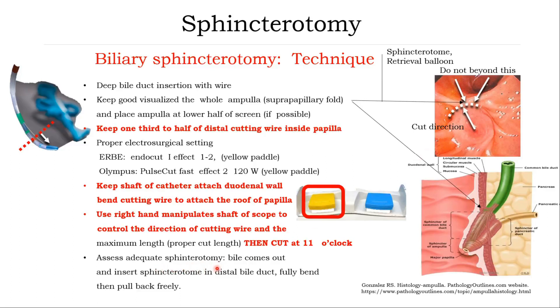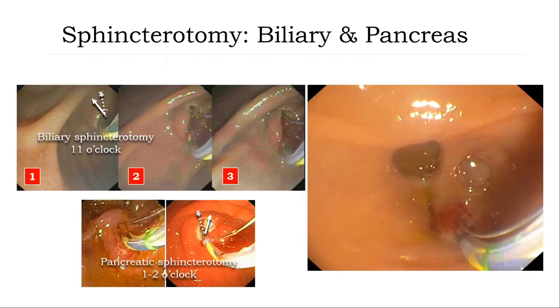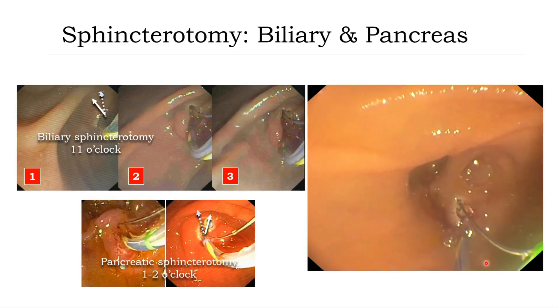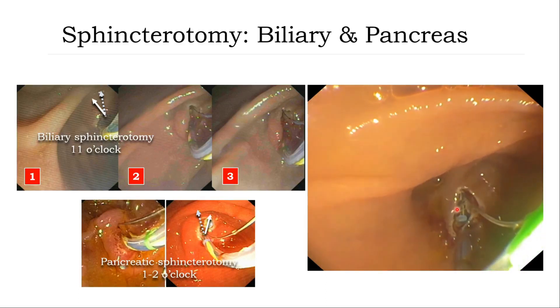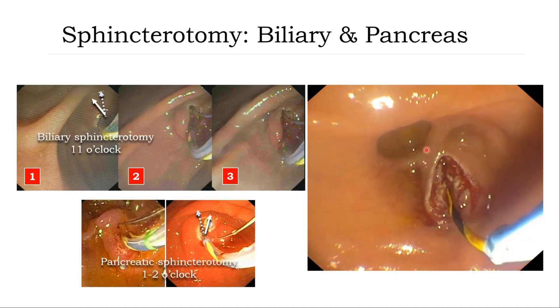Adequate sphincterotomy: you can see the bile duct come out and when you fully bow the sphincterotome, you can put a catheter in and out freely. For pancreatic sphincterotomy, same technique but cut at 1 to 2 o'clock. This short video clip shows biliary sphincterotomy at 11 o'clock: place the sphincterotome attached to the wall, bow the cutting wire, use the right hand to control the duodenoscope and cut at 11 o'clock until you reach the maximum of the supra-papillary fold.